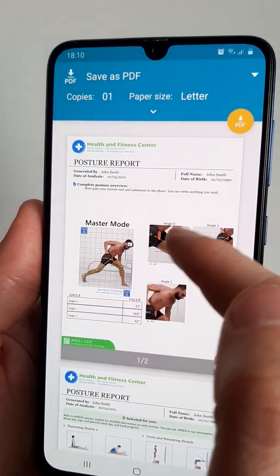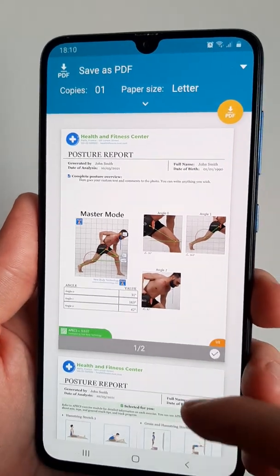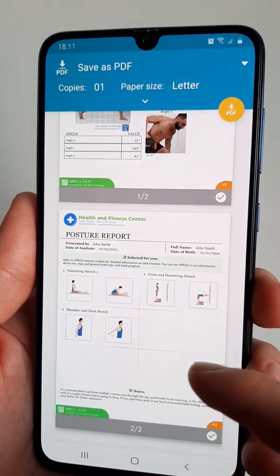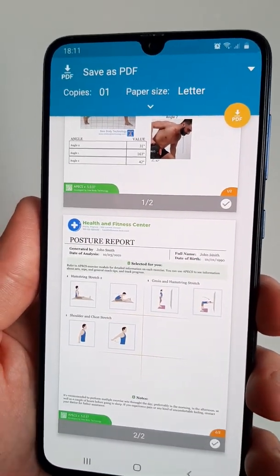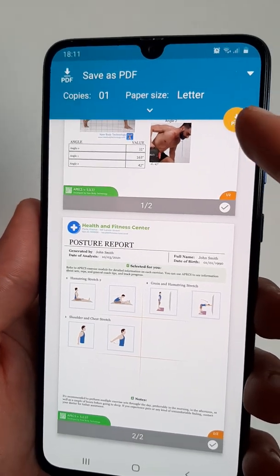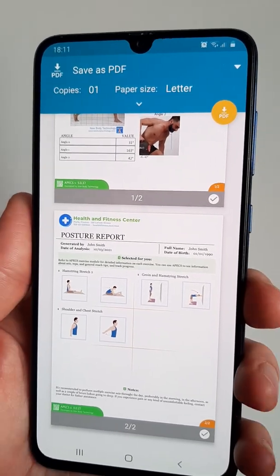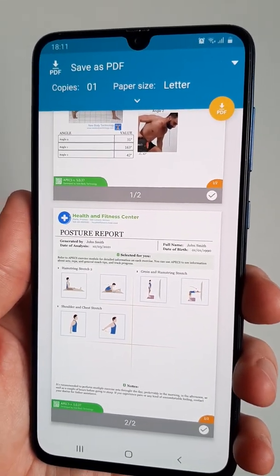You have your commentary, the photos analyzed with the table of angles, and the exercises with your comments. Don't forget to save your PDF report on your phone to make sure that the results are not lost.